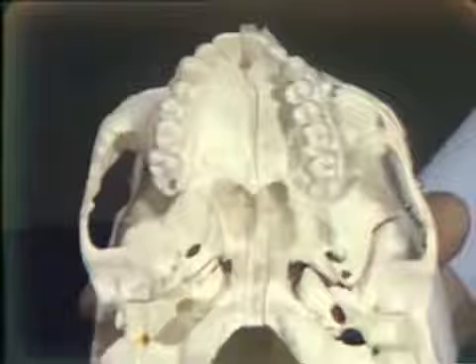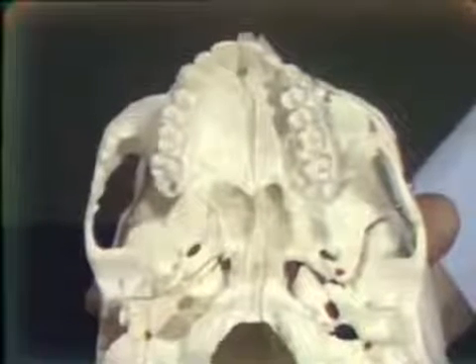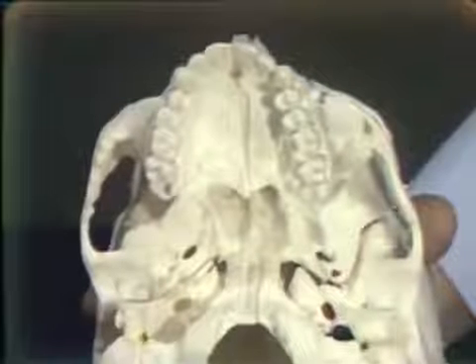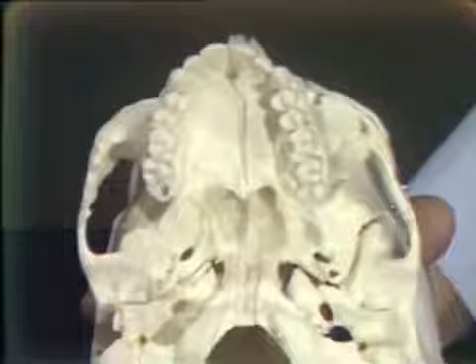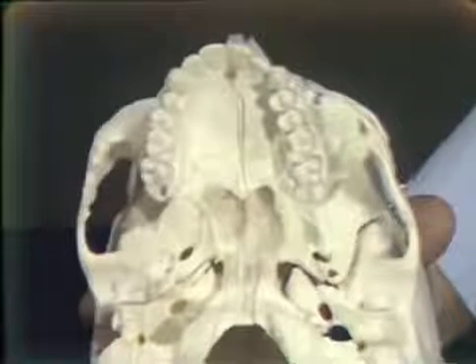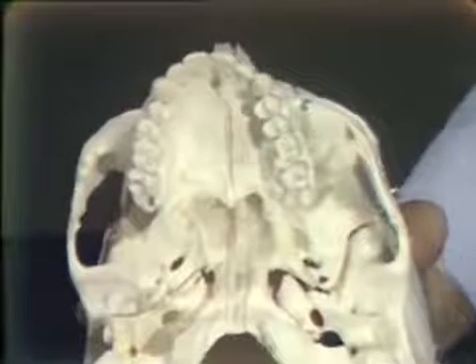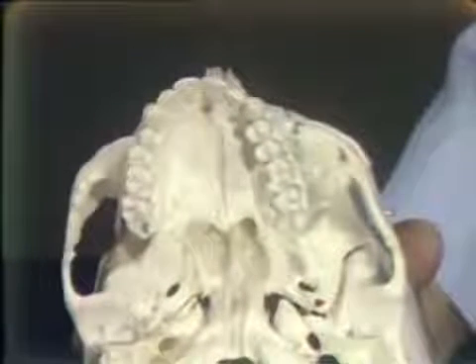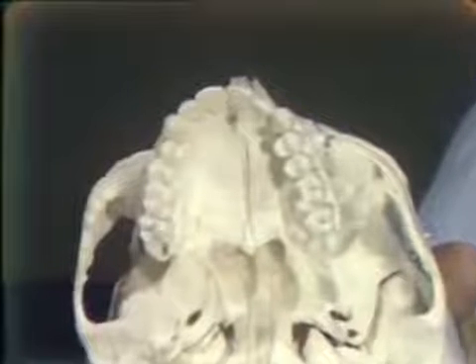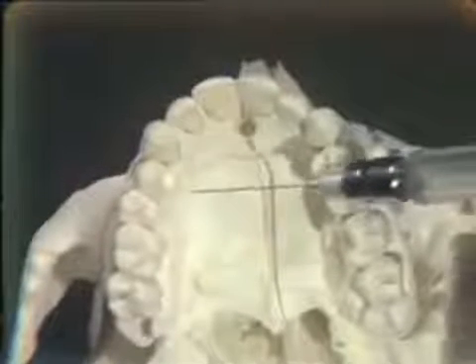Now, on occasion, you may just be carrying out instrumentation on one tooth or removing one tooth. It is not necessary to block the entire anterior palatine nerve, and we can infiltrate just palatally to the tooth in question and so-called get a partial anterior palatine block. Let us suppose we were going to remove this maxillary first bicuspid. It wouldn't be necessary to give the anterior palatine block, but just simple infiltration about a centimeter from the gingival margin on the palatal side of that first bicuspid in such a fashion as this.